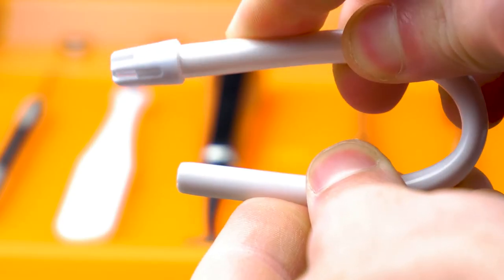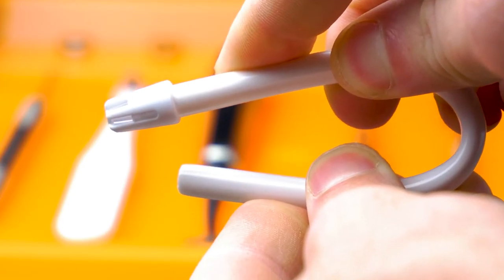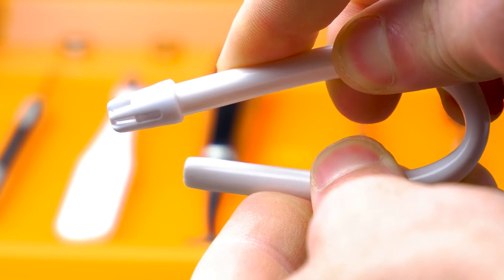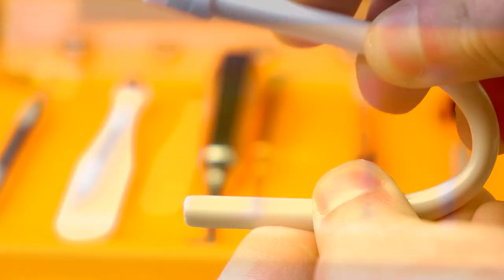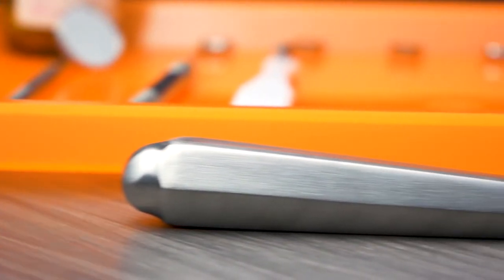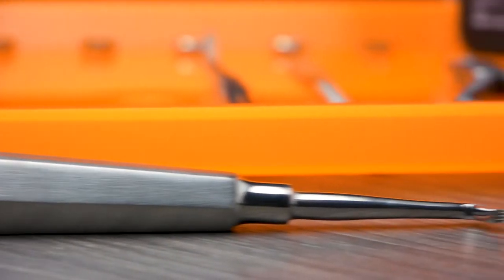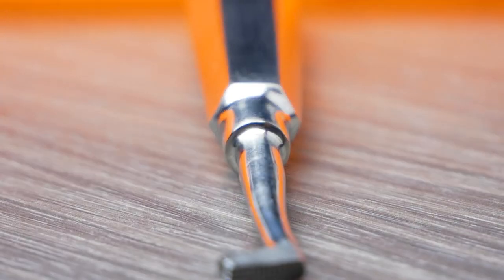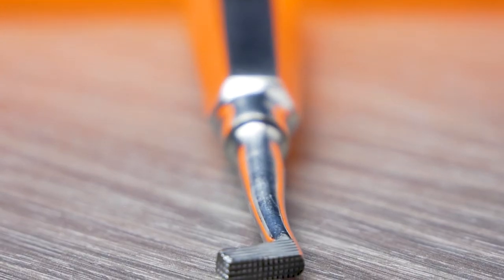The saliva ejector is a flexible plastic tube that is used for removing low-volume fluid from the oral cavity. A band pusher is a metal instrument with a flat tip that is used to push the band in place.